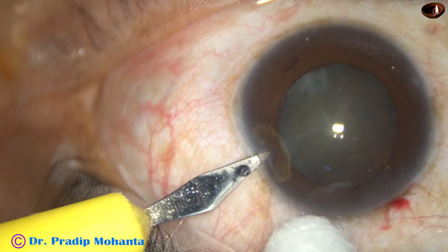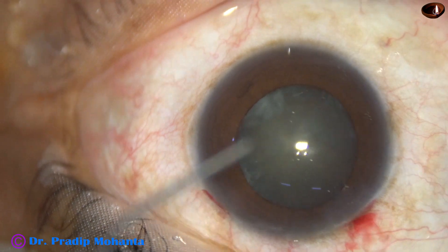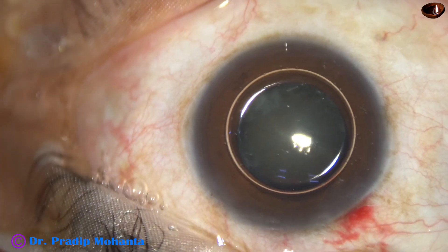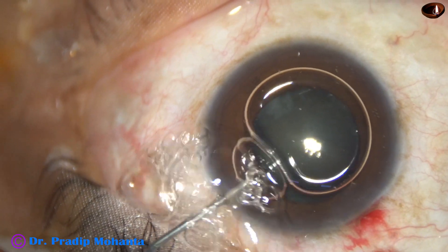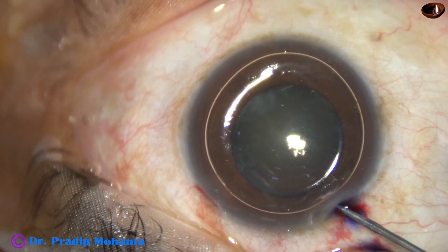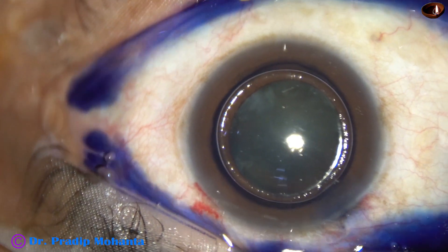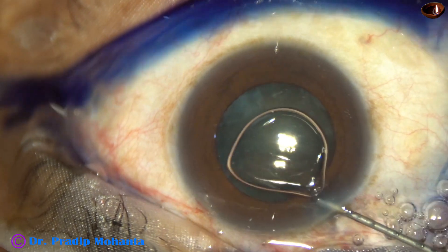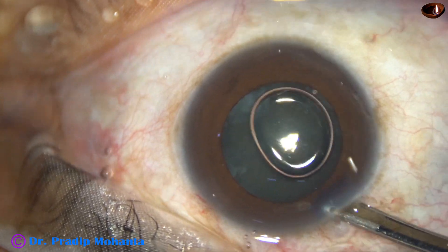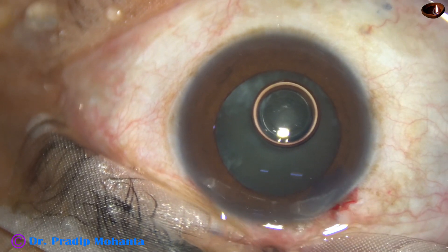This is a sideport on the left side of the main incision, about 3 o'clock hours away. An air bubble is injected into the anterior chamber, and beneath this air bubble, trypan blue dye is applied to stain the anterior capsule of the cataractous lens. This dye will help in capsulorhexis. Uniform staining is important. The dye is washed out using Simcoe cannula and BSS.